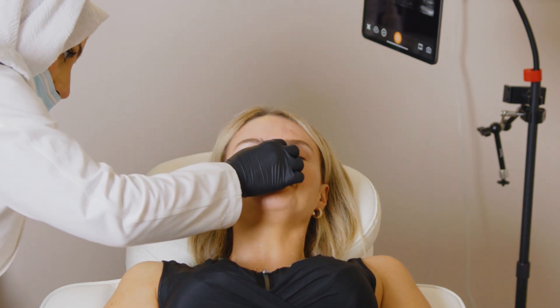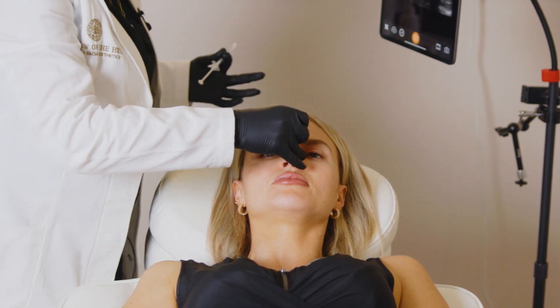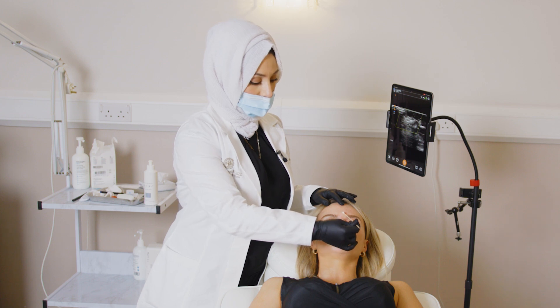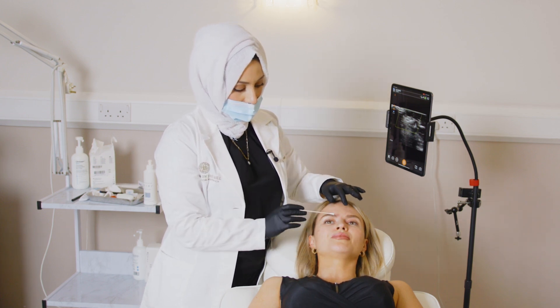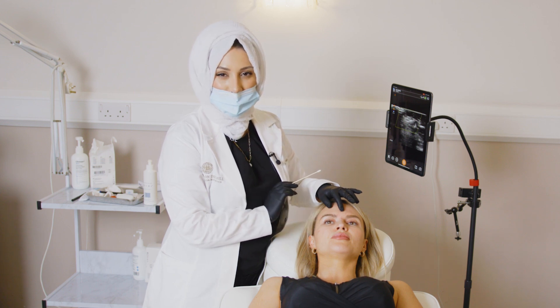How are you feeling? I have now injected the radix of this nose just to improve the nasofrontal angle for this beautiful female face, and to mask or disguise this very slight dorsal hump. Beautiful results.